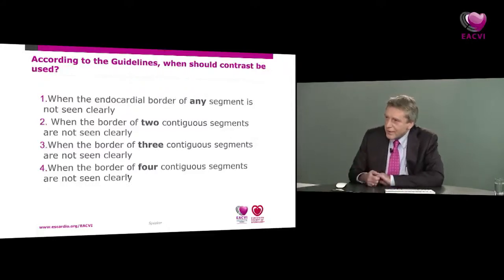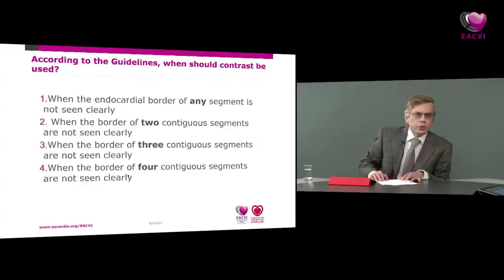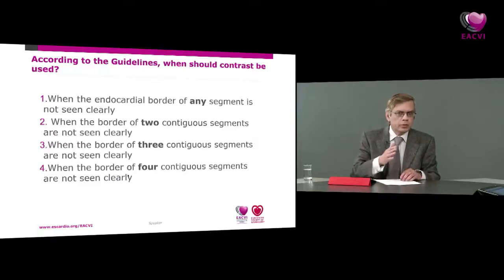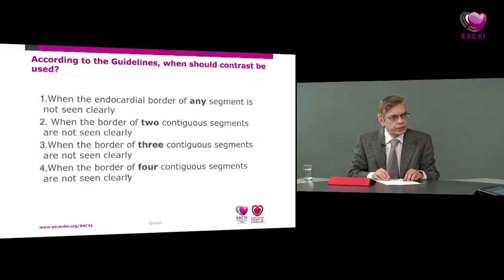I know you do it slightly differently. Yes, so we tend to do both simultaneously in low MI setting, where we can assess perfusion and function together straight away in terms of volume and wall motion. But I gather it doesn't make a lot of difference in terms of diagnosis, whatever setting you use. But yes, it should generally be towards the low MI in order to prevent destruction of the contrast.